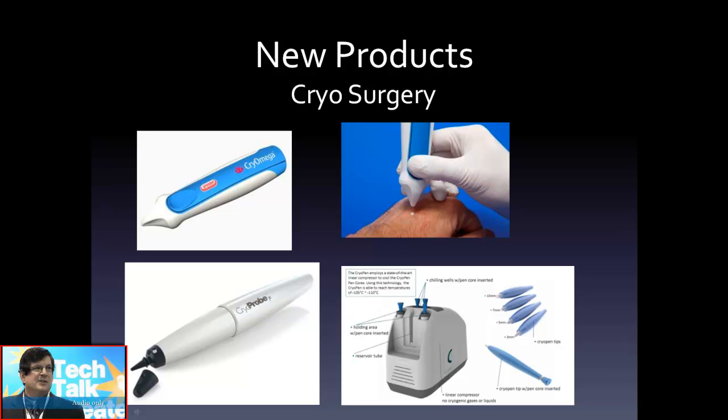A device that I've used in my office for a number of months is the Cryo Probe. It actually uses disposable and replenishable canisters of nitrous oxide. What I like about this device is that it uses replaceable tips, so you can gear the tip to the size of the lesion, the size of the wart you're treating.